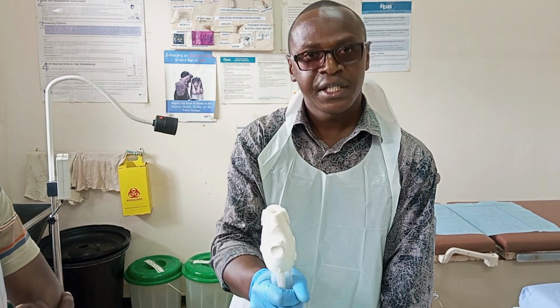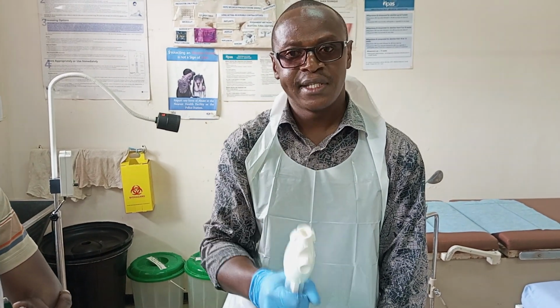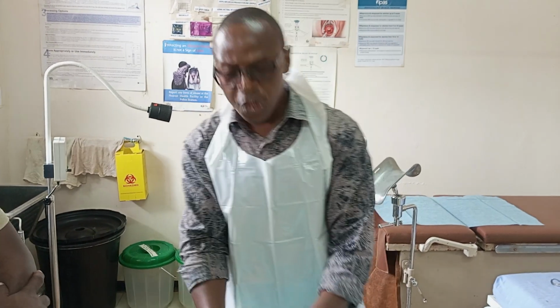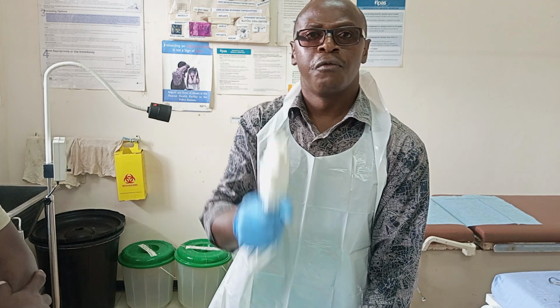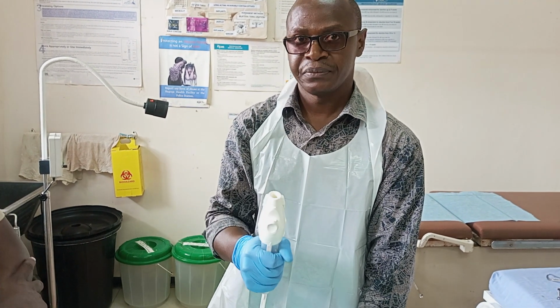So one of the indications for MVA is the evacuation of RPOCs, retained products of conception, from the uterine cavity. Another indication is to manage an induced abortion. There could be other findings that may compel the gynecologist to induce an abortion in the female. So for induction of an abortion, termination of pregnancy, you can actually use the same gadget.